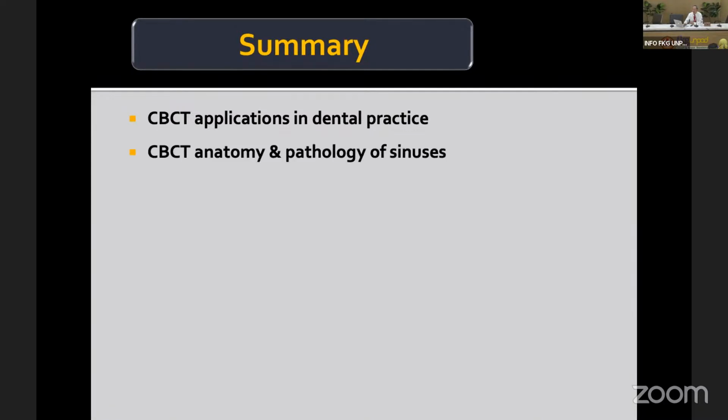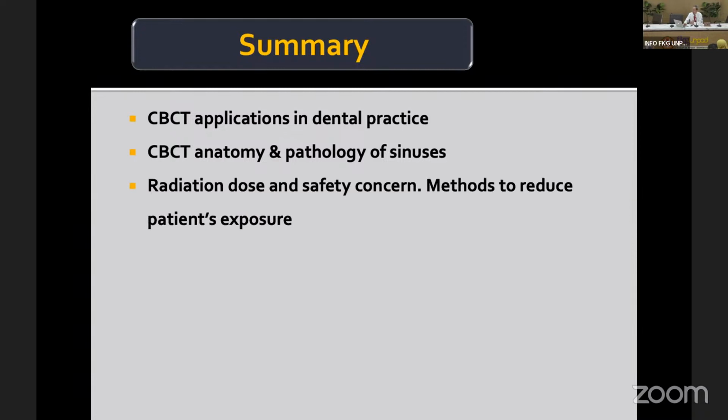Certainly, maxillary sinuses are adjacent to the maxilla, so we often need to know the osteomeatal complex and other normal anatomy, and also the common pathosis and abnormalities in the sinuses. And finally, we also need to know the radiation dose and the safety concerns. If it is possible, help reduce the radiation exposure to your patients.